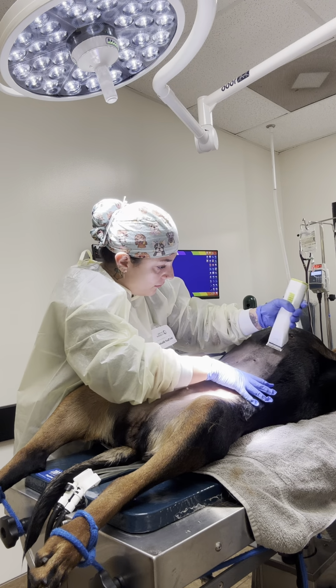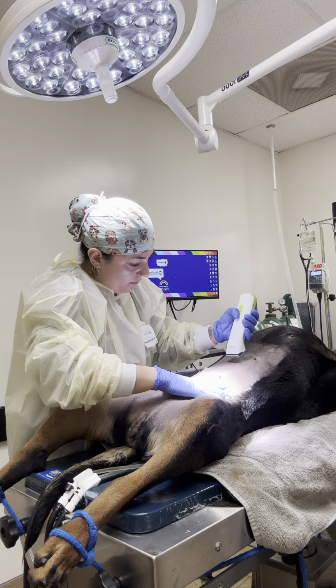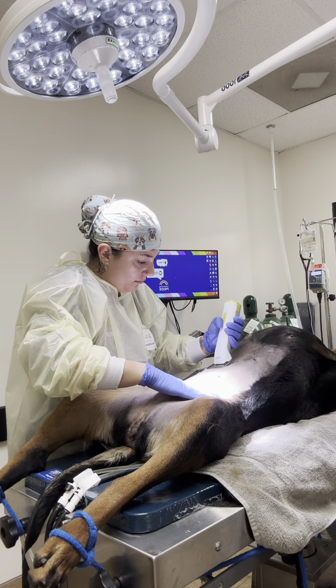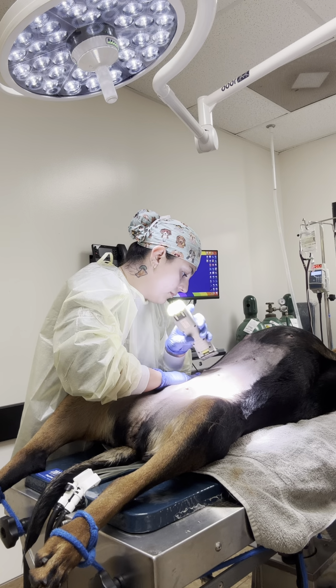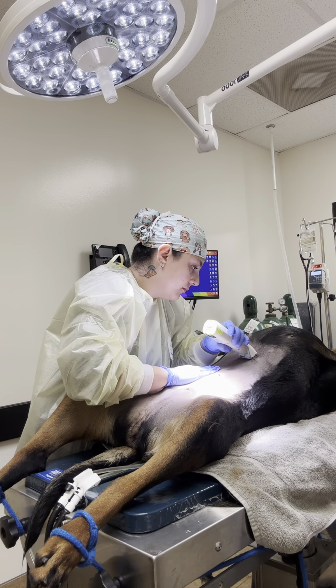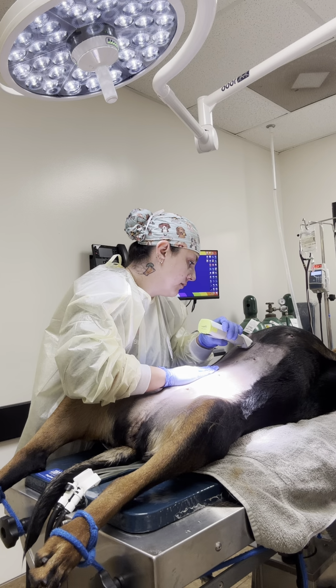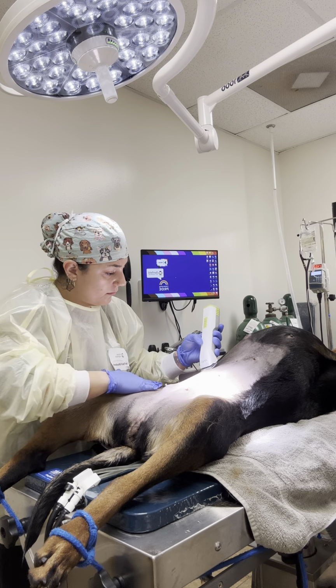That's what you want to learn if you want to be doing anesthetics. So now we're getting into almost tachycardia, which is why we don't give the high end of the dose right out of the gate. And I would have preferred if we were in the 50s to have sat on that half ml, but since we were down in the 40s, I didn't want to sit on that half ml. If we had waited another 2 minutes on that half ml, I'm pretty confident we would have ended up in the 80s.